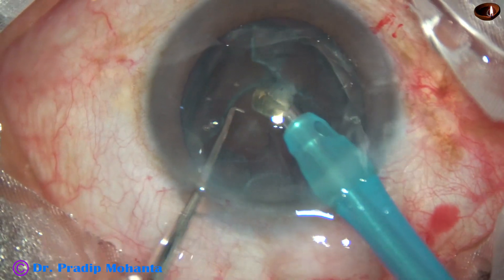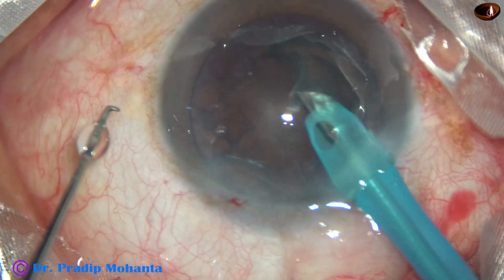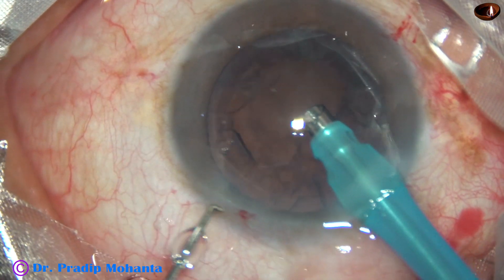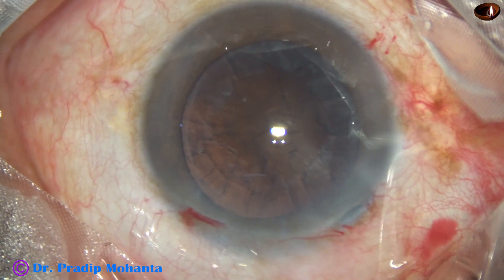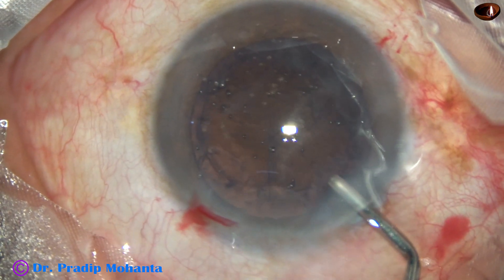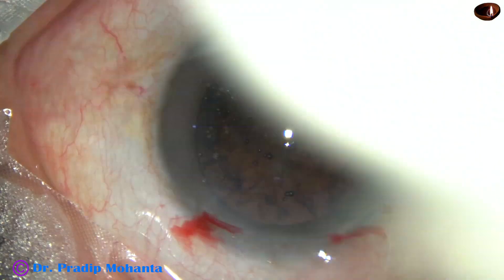Now this is the epinucleus. Always be very careful when you try to hold the epinucleus. Many times, posterior capsular rent occurs as you try to hold it. You can come out, inject some viscoelastic behind the epinucleus, and do it more safely.